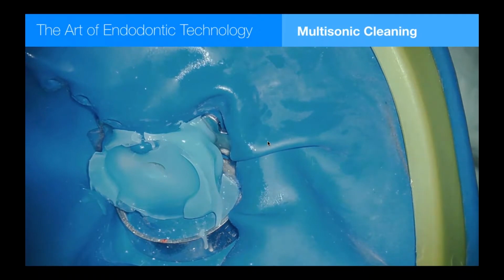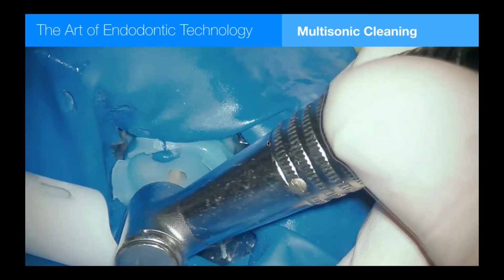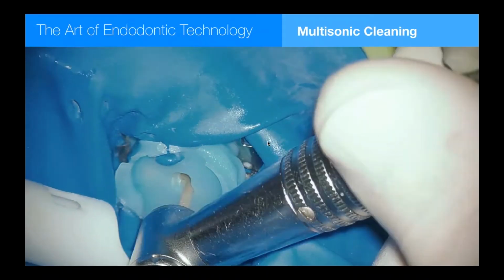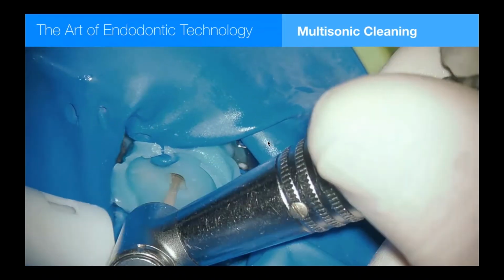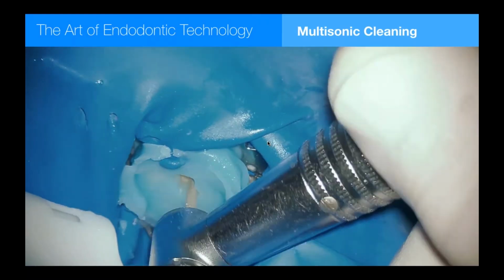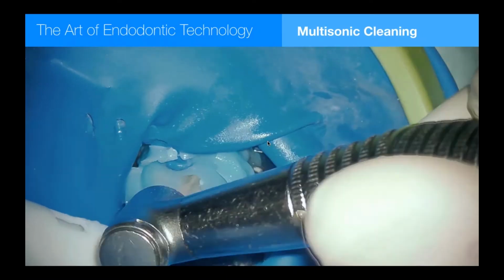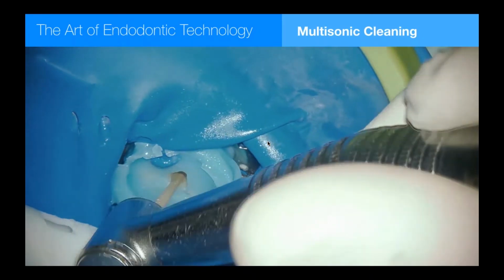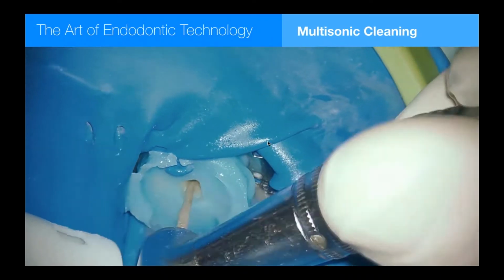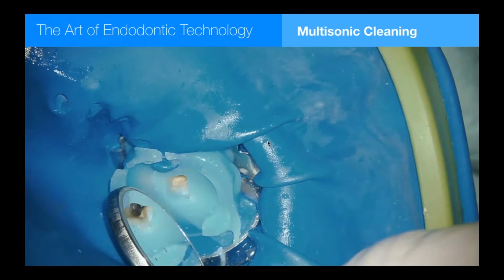Following the light curing, I use my LA access burr. It's a guided burr. I go in there and I cut the stage opening to match the access prep. Guided burrs are really great because they don't cut a bigger access prep. They just cut the staging material above it. It turns out it's really critical when you cut this that you don't leave any little fins on the sidewall of the access cavity, because that will encourage flow of solutions up and under the seal here.